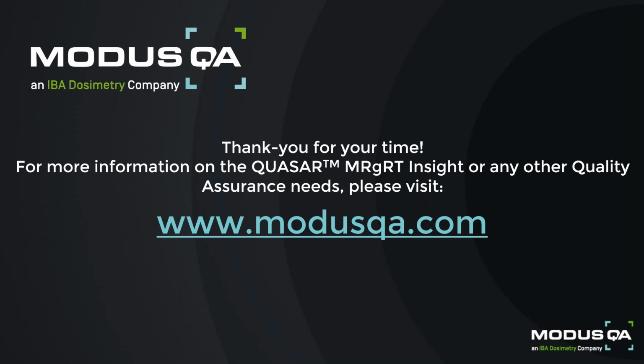On the other hand, the MRgRT Phantom, which was the topic of our talk today, allows you to assess your system's GD as part of a series of tests that you can perform during QA. So not only are you assessing your distortion, but you can also assess your image quality, your spatial resolution, and your slice thickness, all at the same time.